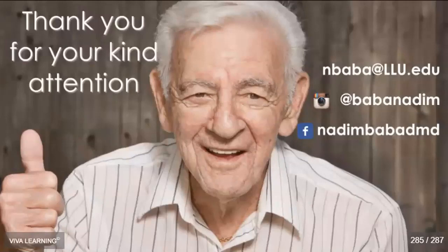Now, the first question that I have is from Jen. He asked, does the software suggest certain teeth molds based on landmarks and measurements? No, the software does not suggest any teeth mold. You will pick the teeth mold according to the measurements that you made, the papillometer reading and the inter-alar measurement. That's what you need to do to figure out the teeth mold. The software does not give you any suggestion.